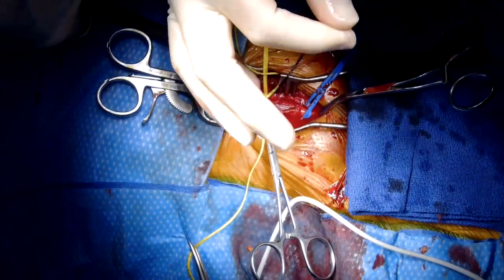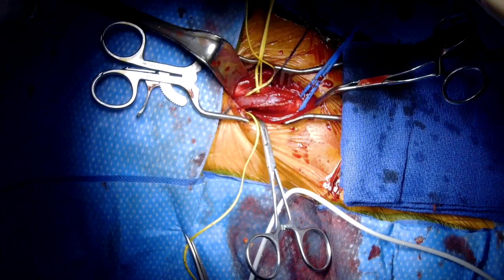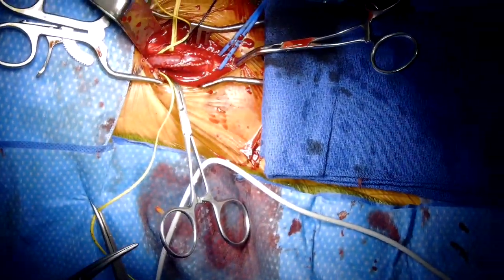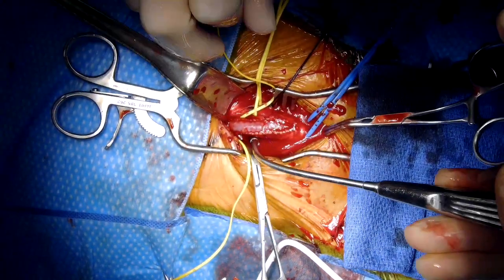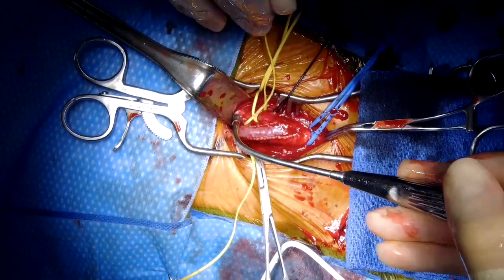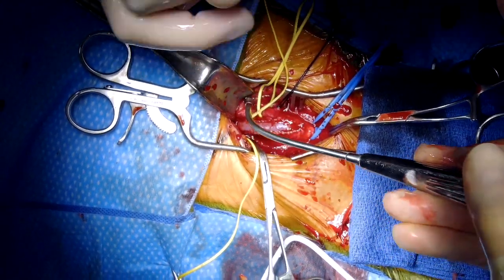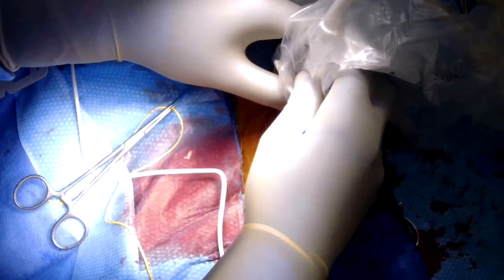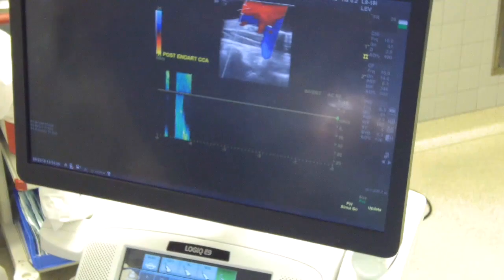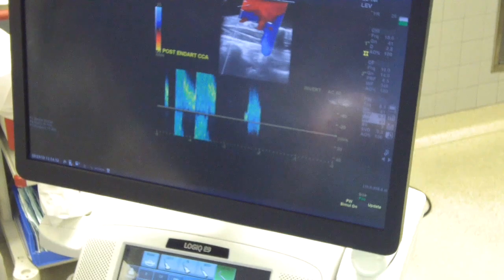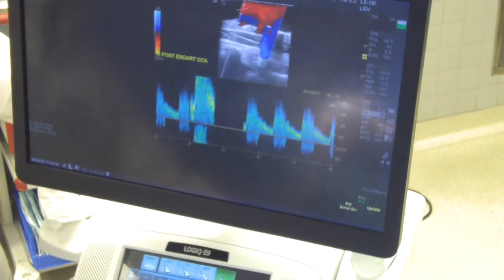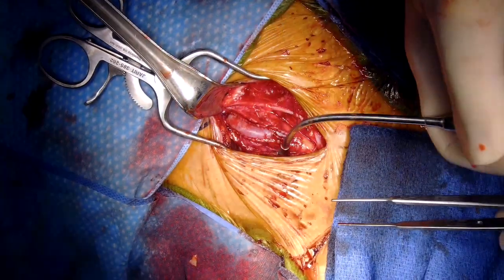Flow was reestablished by first unclamping the external carotid artery, followed by the common carotid artery, and then the internal carotid artery. The suture line was checked for hemostasis. Duplex evaluation revealed excellent flow through the common carotid, internal carotid, and external carotid arteries, without any intraluminal defects.